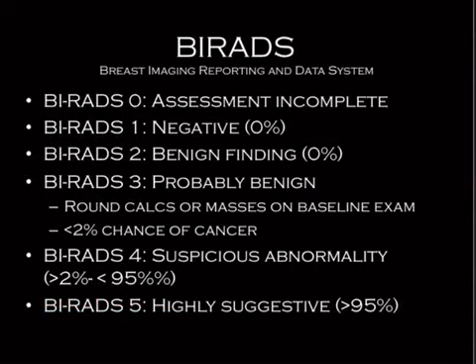Now, BIRADS also groups things into the standard reporting. It isn't just for vocabulary words, it's also for risk stratification, and it helps you decide what you're going to do. So, BIRADS 0 is something that means the exam is incomplete. If you were doing a screening set and the posterior nipple line didn't add up on the CC, that would be an incomplete exam. That would be a BIRADS 0. If there was blur on the image that made it unreadable, that would be a BIRADS 0.